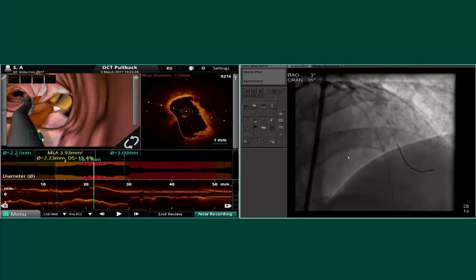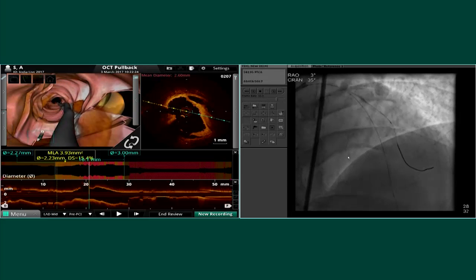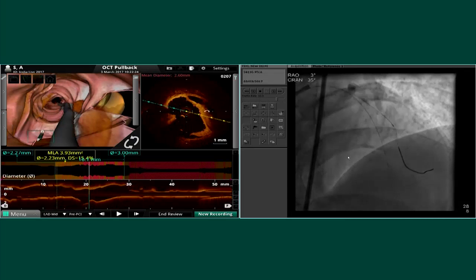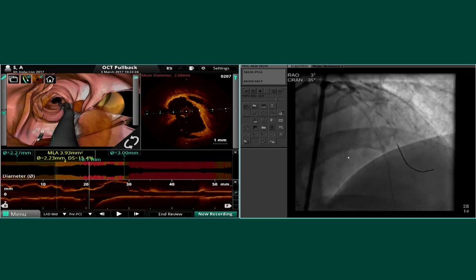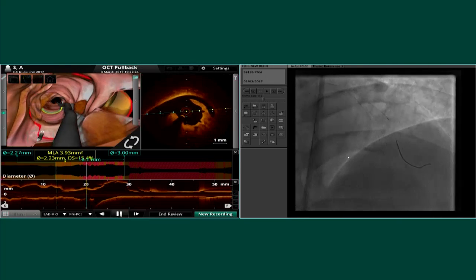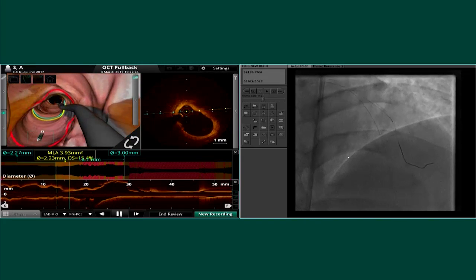So here I am actually, remember all that diagonal was diseased? It's a reasonable size diagonal which is occluded, so I've crossed it. And now I'm going to actually just dilate it and then deal with that. So here we come into the diagonal.